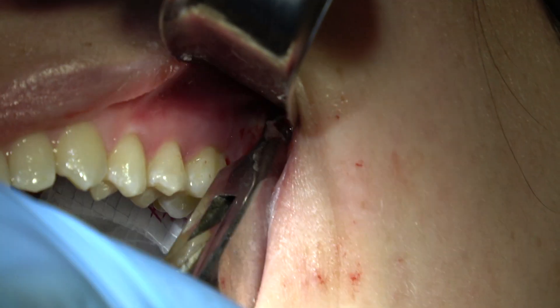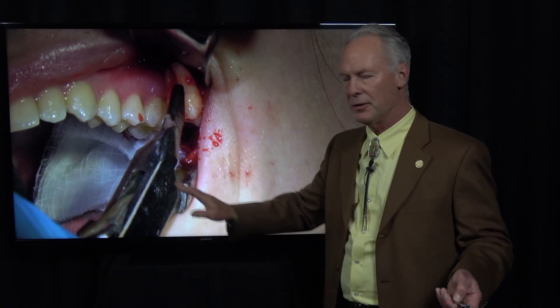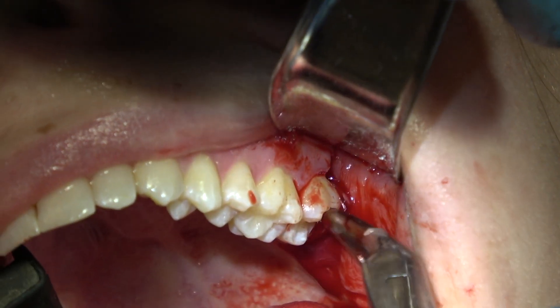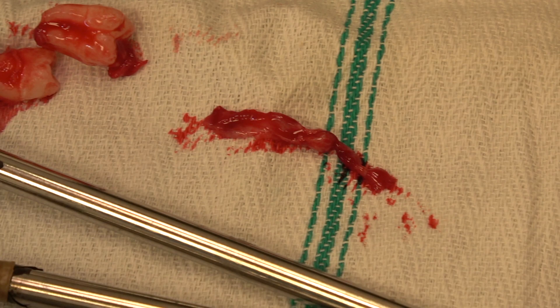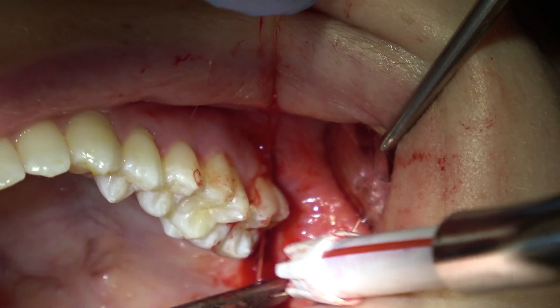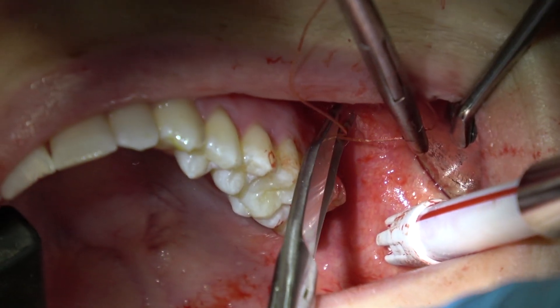Be sure to protect the airway with a two-by-two. You don't want that tooth popping out and the patient aspirating it. Now going back and removing the follicular sac with my rongeurs, then placing one suture — 3-0 plain gut. Two sutures for mandibular wisdom teeth, one suture for maxillary wisdom teeth.